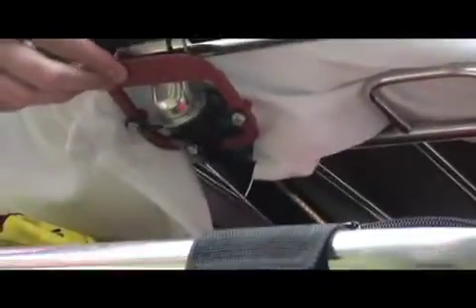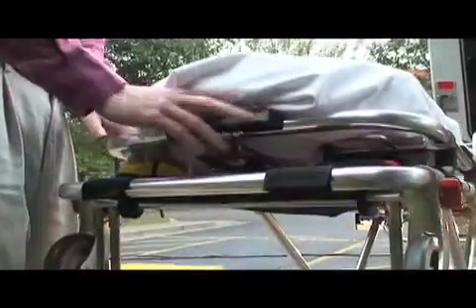The last part about the stretcher is raising and lowering the head. Both of our stretchers have a hydraulic on them, so if you squeeze this button, then the head will come up, and then you kind of have to use a pretty good bit of force, but you pull down once the button's pressed and the head comes down. So you can set it to wherever it is that you need it.